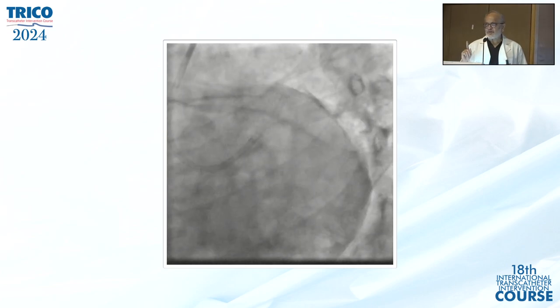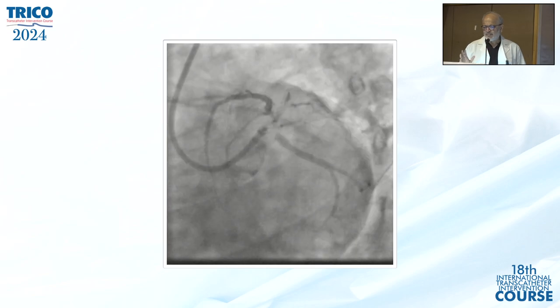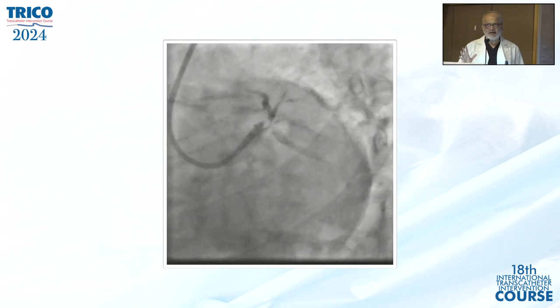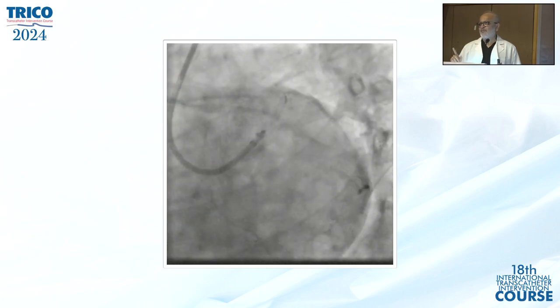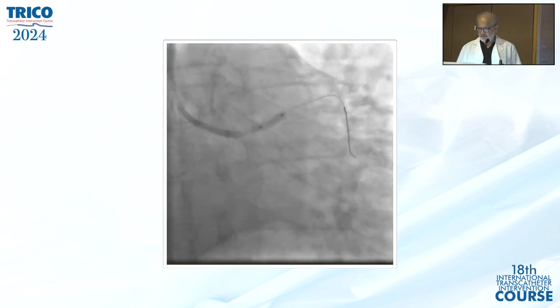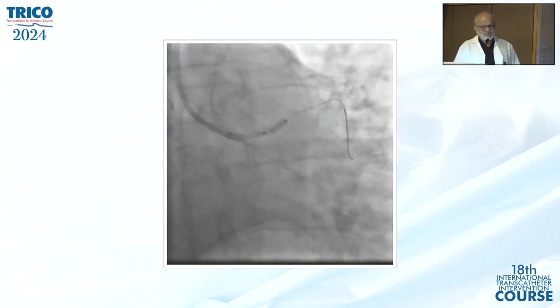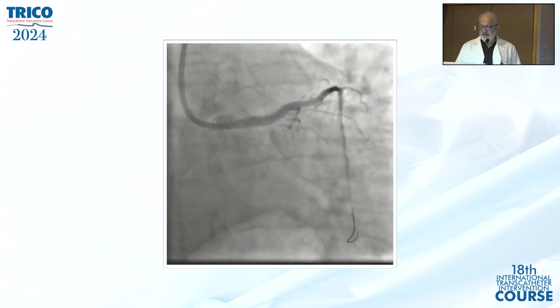the first thing you have to do is the first wire has to go in, and ideally if you can manage, it should go in the LAD. Because if you establish the blood flow in the LAD, your patient will remain alive. Forget about two wires, nothing. That is exactly what I did.